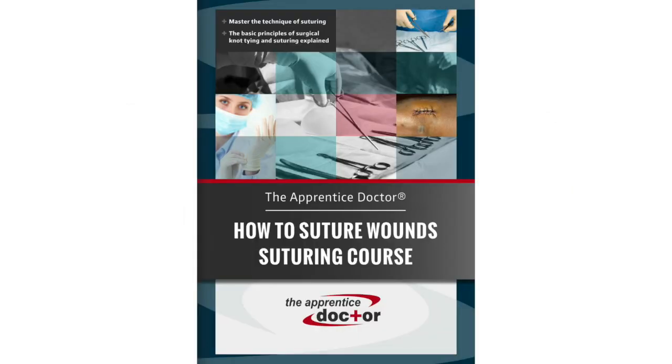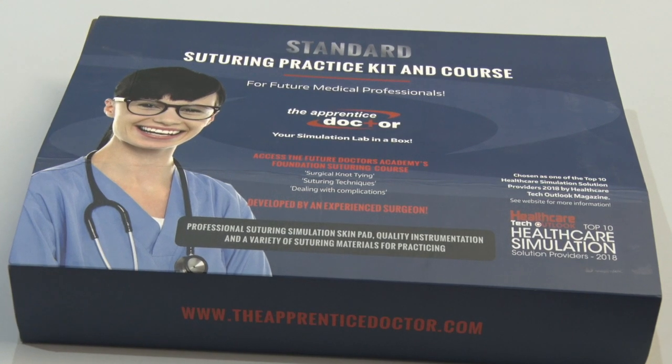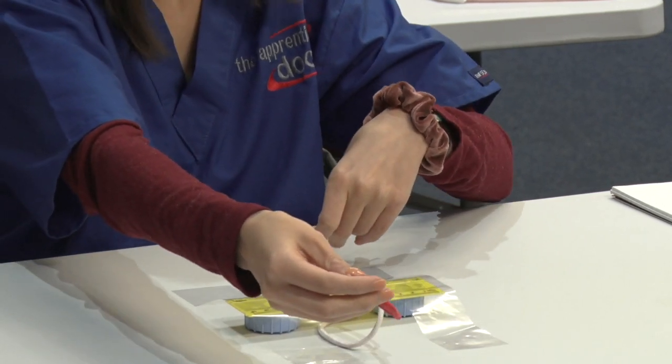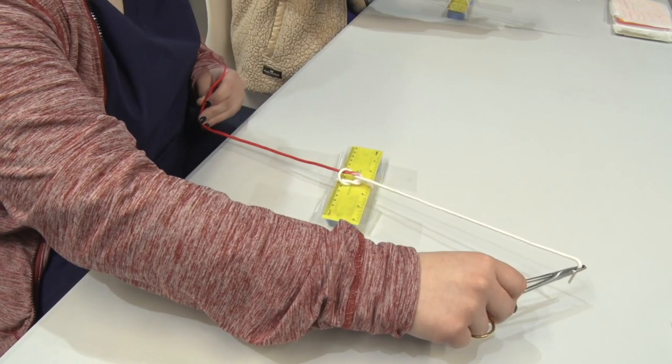The Apprentice Doctor's Suturing Kit is an amazing resource for teaching individual students the art and science of suturing. It is also an ideal tool for teaching surgical knot-tying and suturing techniques during basic surgical skills workshops.